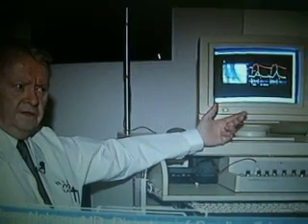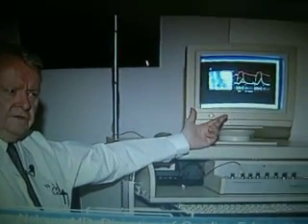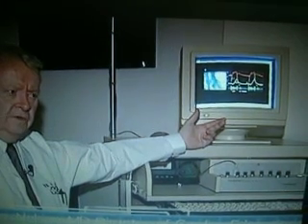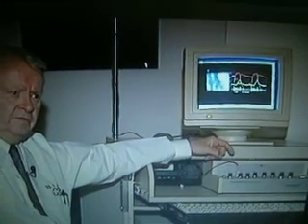So my experience with this equipment through a lot of years and through a lot of students and house officers is that the simulated events and the recorded real-time events have appreciable increase in their abilities at the bedside.